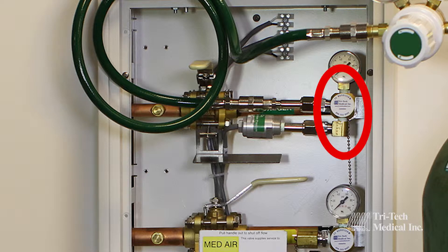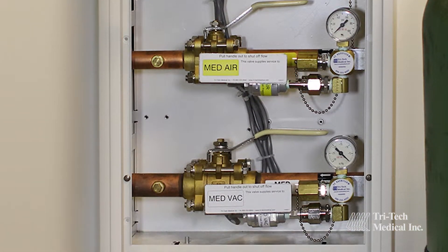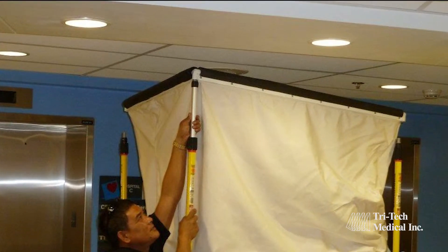The dual-port Easy Backfeed gives you the ability to locate your area alarm sensors in the easily accessible zone valve box, eliminating the need to open the ceiling to search for them when replacement or testing is required.